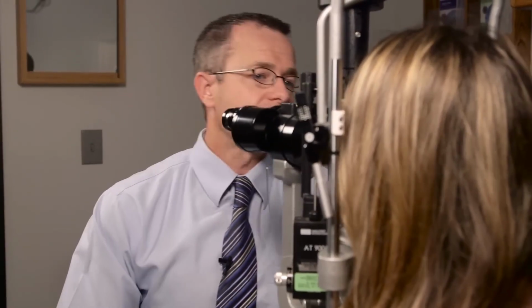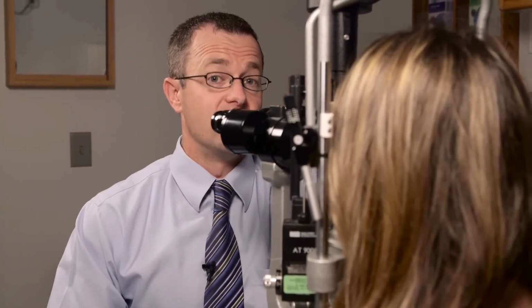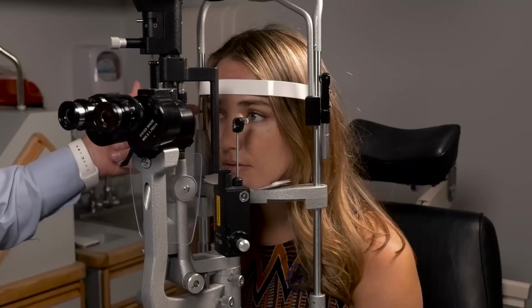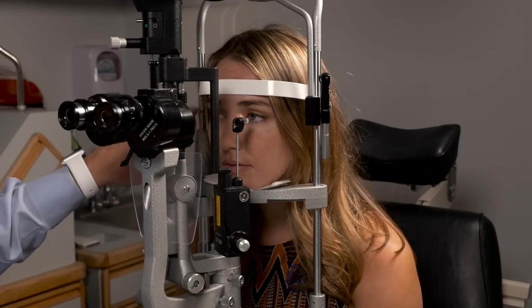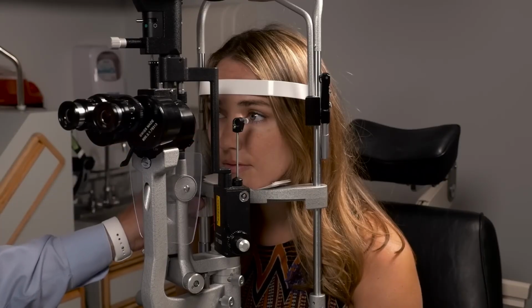You don't have to hound it too much. It's not the end of the world. And then I'm looking, you can't see it right now, but I'm currently looking at that black mark on the right side, and I'm looking at the patient's lateral canthus, and I'm going to make sure it's lined up. And it's nicely lined up right there.